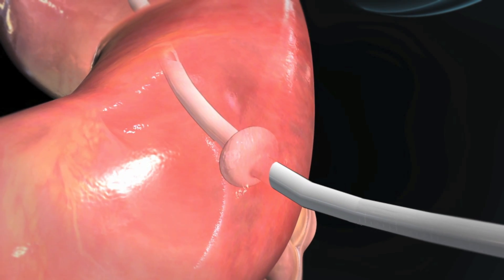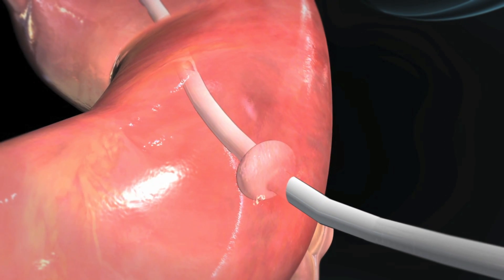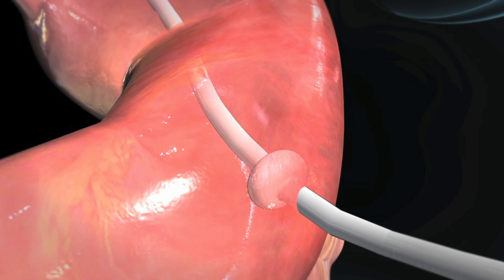A soft, round bumper attached to the portion of the tube that remains inside the stomach helps secure the tube in place.